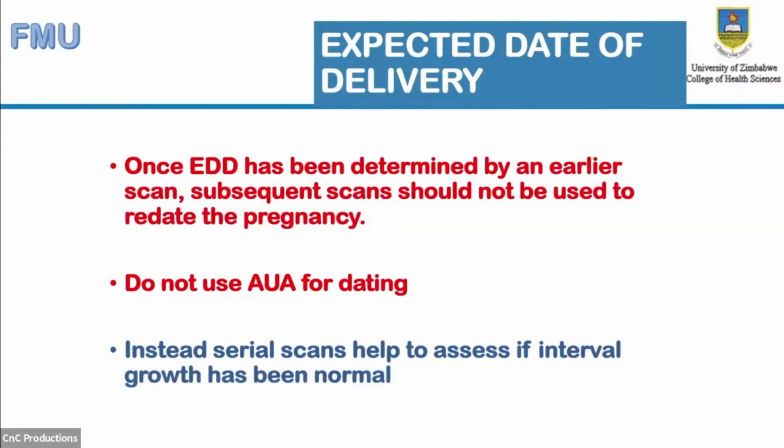and any subsequent scan which is done should take into consideration that gestational age. So you shouldn't redate a pregnancy. I think one of the common practices, especially in the sonography and radiography world, was that every time a woman would come, they would be given a new due date.